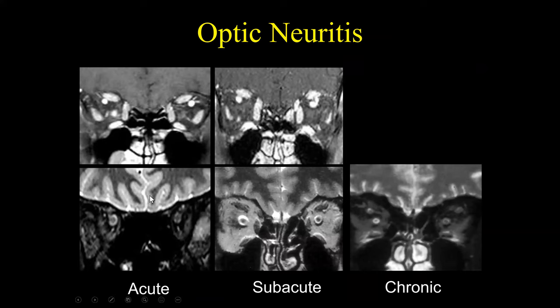When you do things just right, you can actually grade the acuity of optic neuritis. In acute optic neuritis, what you see is diffuse enhancement of the right optic nerve. On the heavily T2-weighted images, you may see a little bit of increased signal in the surrounding CSF and possibly some increased signal involving the right optic nerve, but the main finding for acute optic neuritis is that diffuse enhancement.